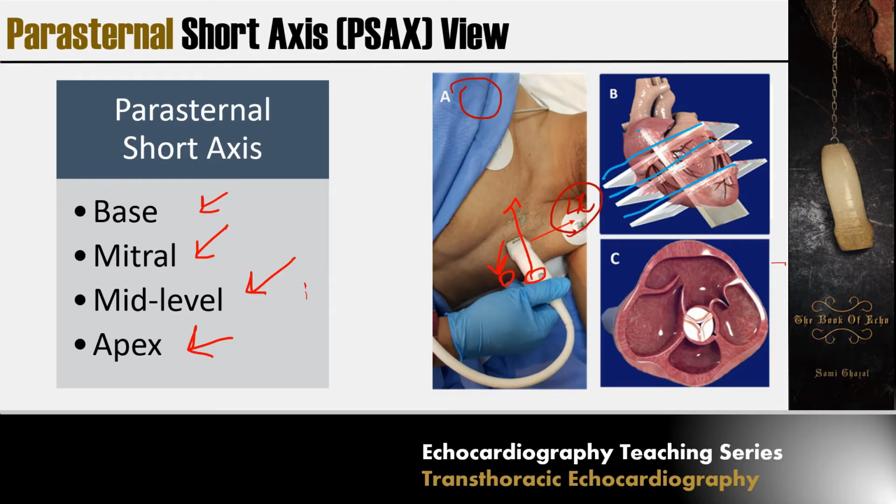And if you reach a point where you cannot image the apex or the mid-level properly, you might also need to shift the probe one level below.